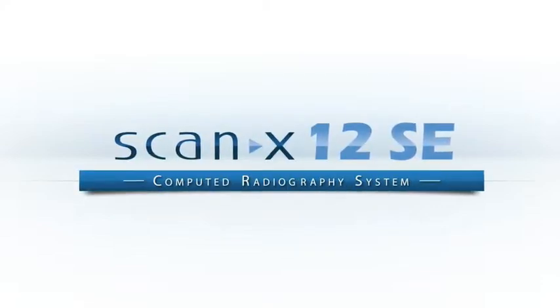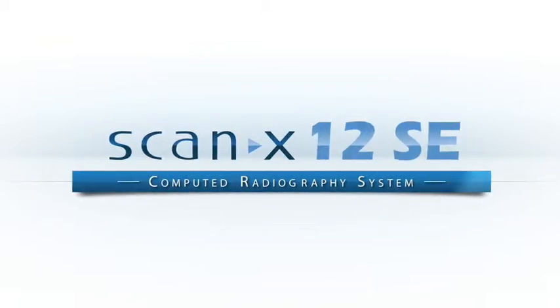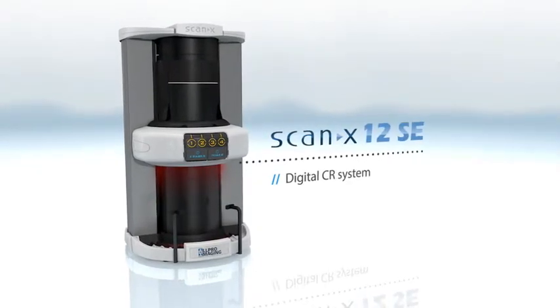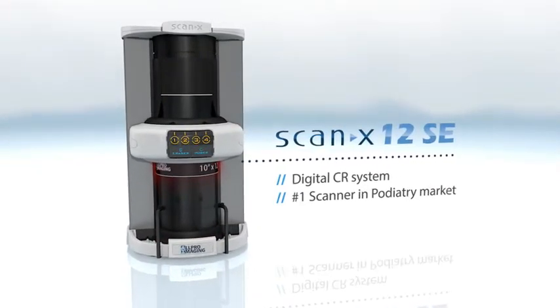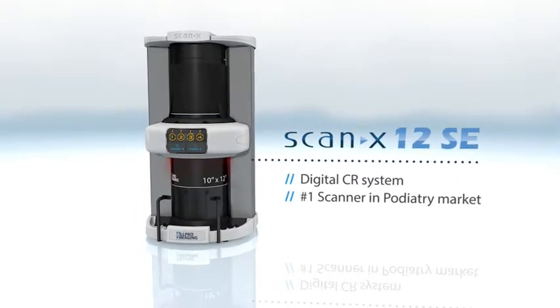Introducing the ScanX 12 SE, manufactured by AllPro Imaging, the number one selling digital solution in the podiatry market for the last 10 years and counting. The ScanX 12 SE gives you the flexibility and durability to enhance your practice for years to come.